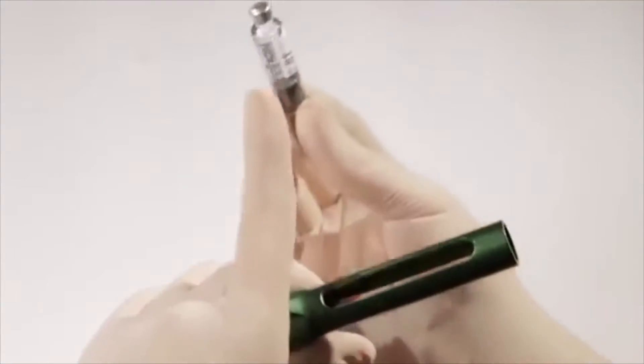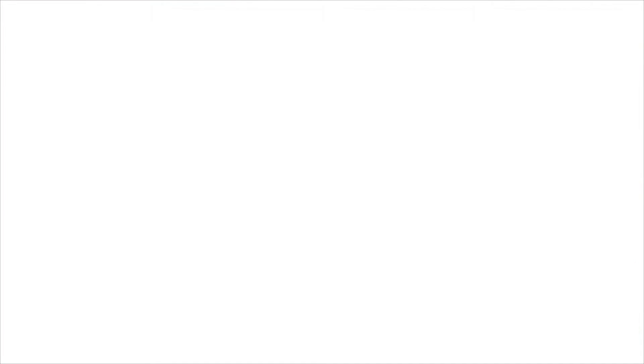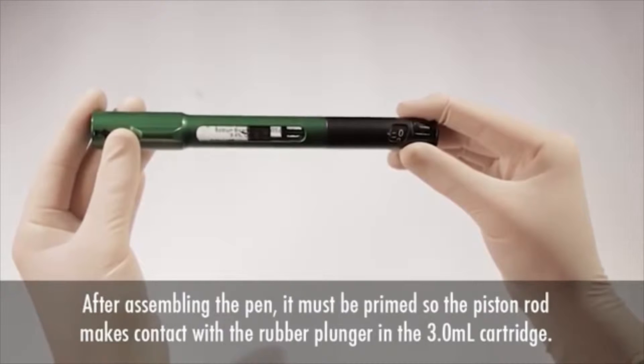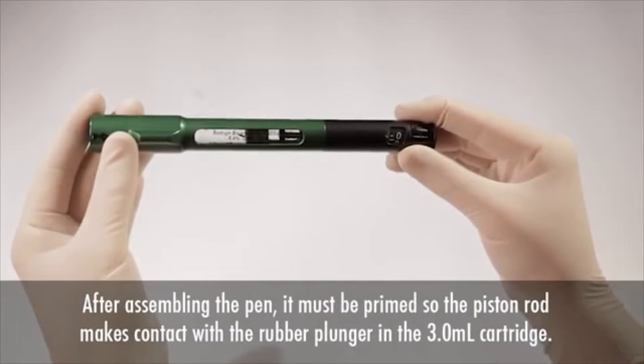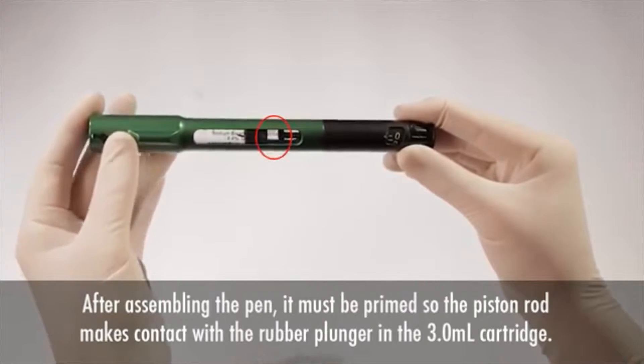Then insert a 3-milliliter cartridge into the small end of the pen's chamber with the septum entering first and screw the pen back together. After loading a new 3-milliliter cartridge into the pen's chamber, you must prime the pen by moving the piston forward until it contacts the rubber plunger on the 3-milliliter cartridge.